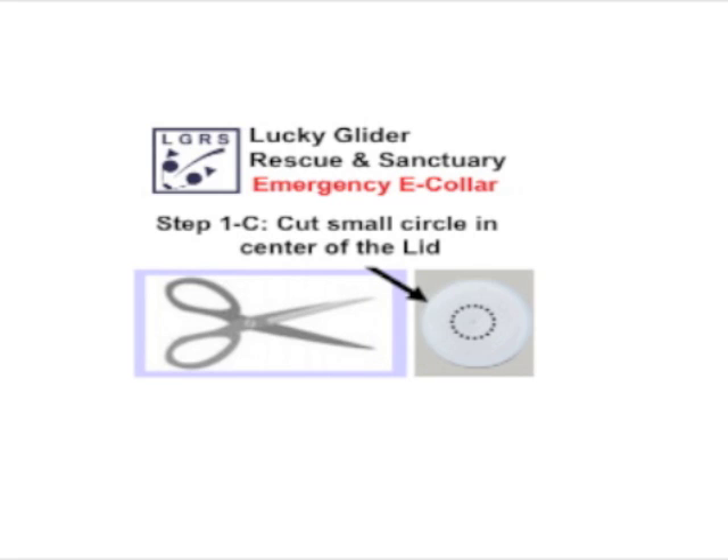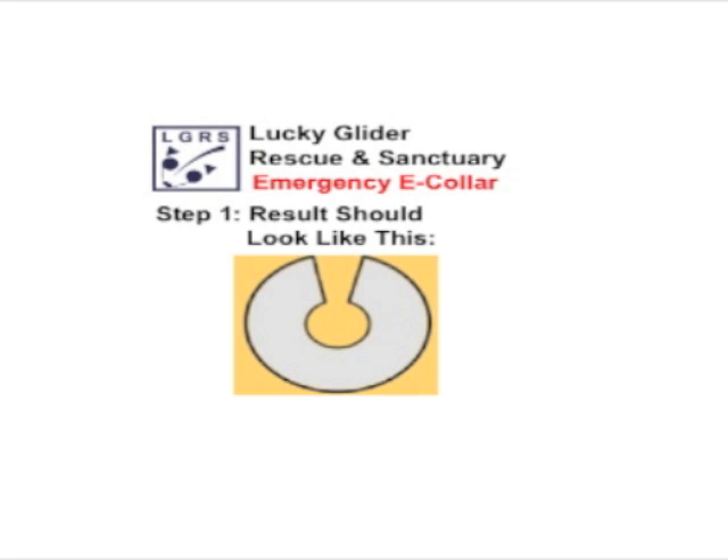Once you've got that V-shape cut in there, very carefully go in with the scissors and cut a circle in the middle of the lid, down around where you cut three-quarters in. The result of your handiwork should look like this — kind of like a donut with a V cut out of it.